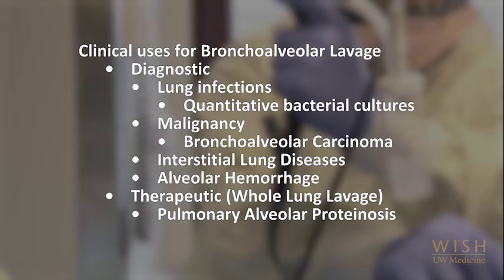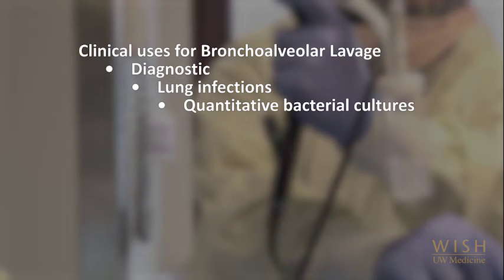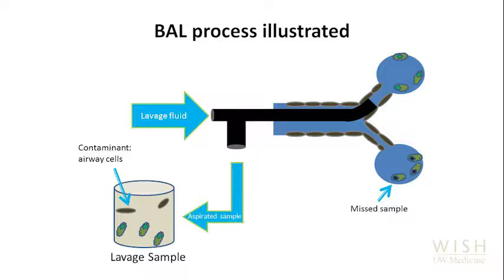BAL offers access to the lower respiratory tract secretions, leading to a more accurate diagnosis of respiratory failure caused by infectious etiologies. Other indications for performing a BAL in patients are listed, but are not frequently performed in the ICU, and therefore will not be further discussed.